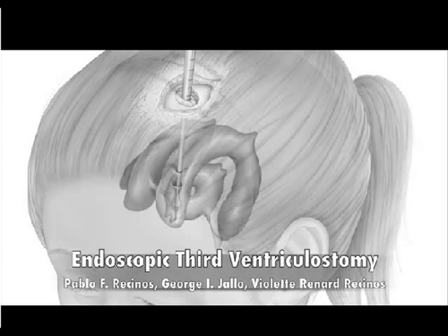In this short movie, we will be reviewing the highlights of endoscopic third ventriculostomy for the treatment of hydrocephalus.